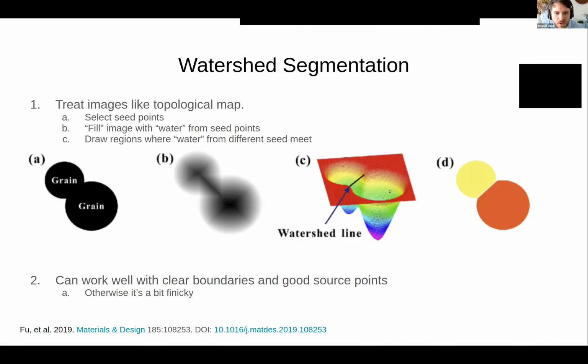In the interest of time, I'm going to skip over the worked part of this, but you can go do it for yourselves. In practice, I find this technique probably works really well for some applications, but for this segmentation problem, a bit less so. It would probably work better if you have, let's say, a bunch of somewhat overlapping cells, and you want to be able to split those cells apart. That might work better.